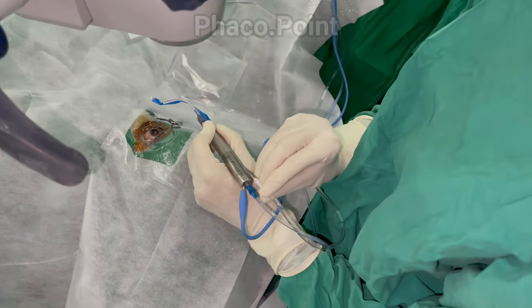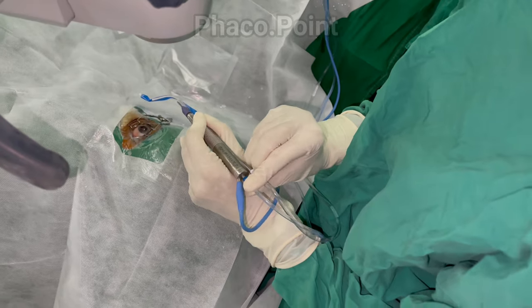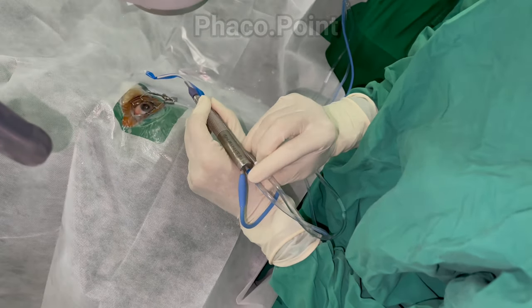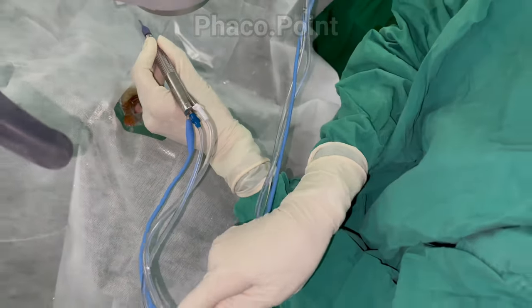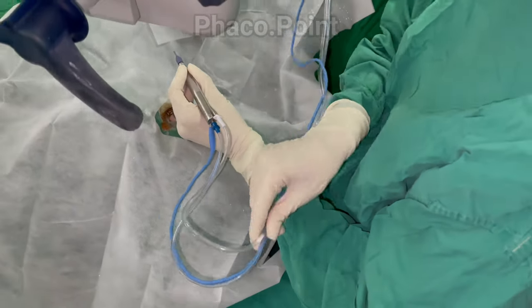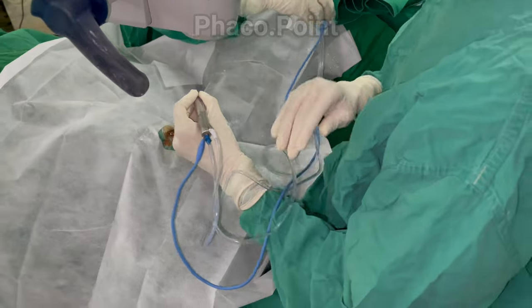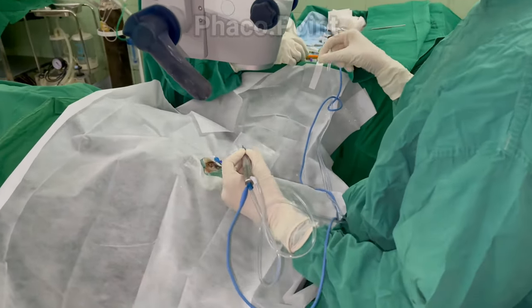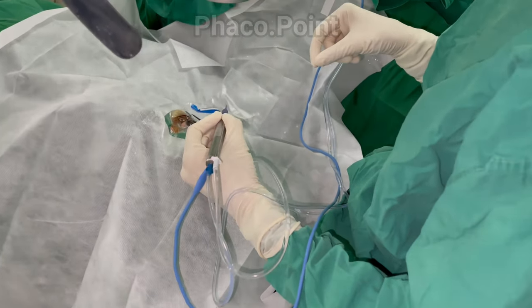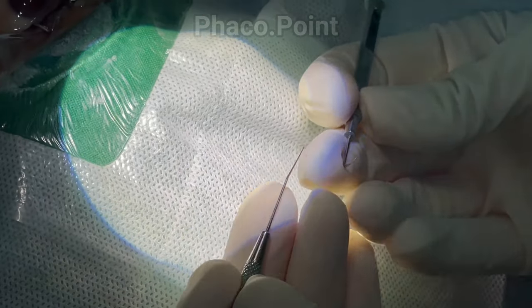Point four: ensure that your irrigation and aspiration tubings are firmly fixed on the phaco handpiece. Point five: ensure there is sufficient slack in the tubings so you do not accidentally nick them, which could result in obstruction to inflow or outflow.